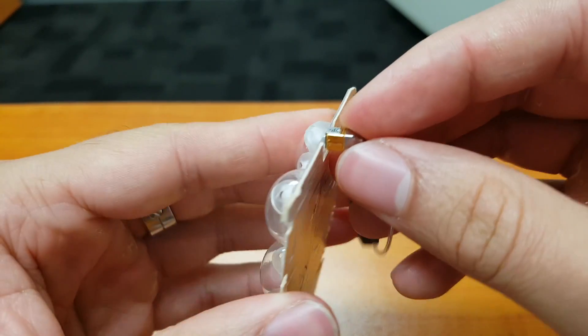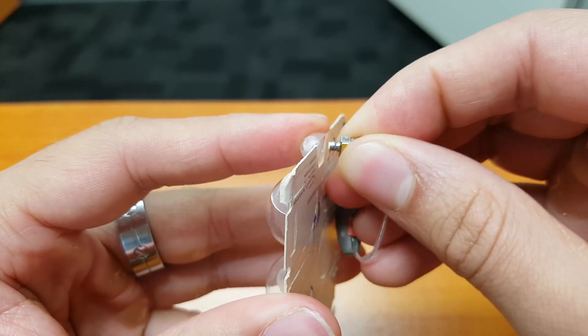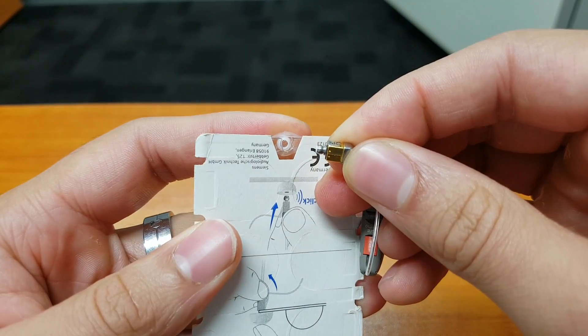Now what we'll need to do is give it a bit of a twist and a pinch, and that will dislodge like so.